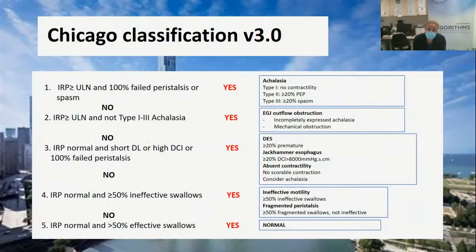Naš kateter je višekratni, kao i svi manometrijski kateteri. Čistimo ga naravno mehanički i potapamo u dezinficijens od 5 do 15 minuta, ovisno o otopini. Jako je bitno paziti o kojoj se otopini radi, kako ne bi na našem kateteru izazvala koroziju ili nemogućnost daljnjeg korištenja. Jako pažljivo moramo i postavljati sam kateter jer se na njemu nalaze senzori, koji se mogu oštetiti.